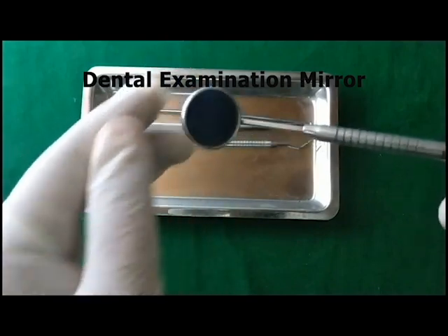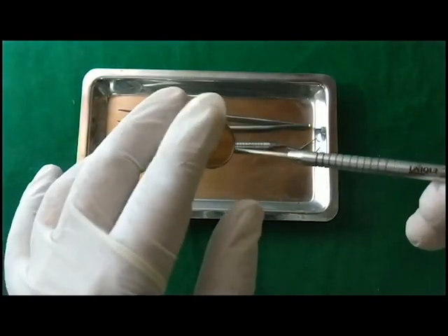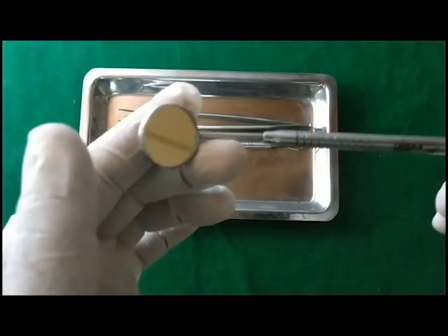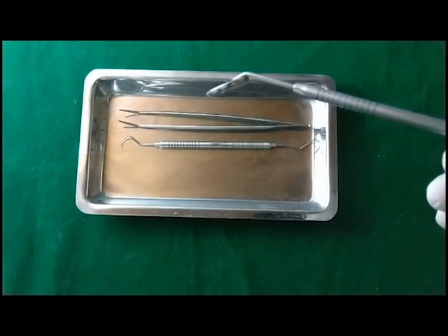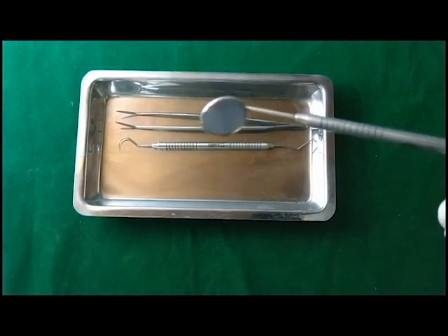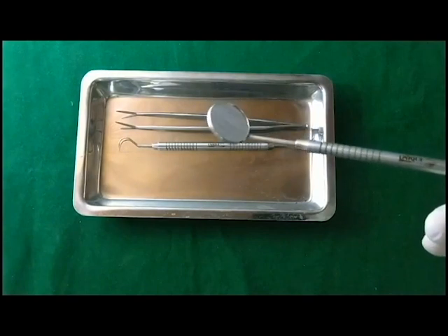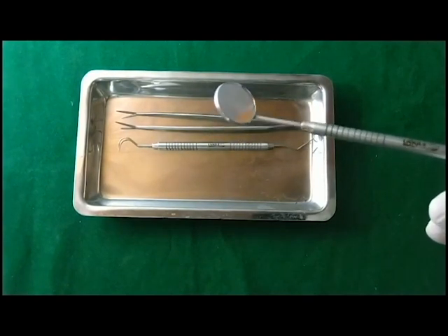There are plain mirrors — for example, this is a plain mirror. There are also some mirrors that magnify the size of the object. These mirrors are used to retract soft tissue, so you can protect the soft tissue during a dental procedure. Secondly, you can also use it for indirect vision — for example, you can use this mirror to see the upper maxillary arc.